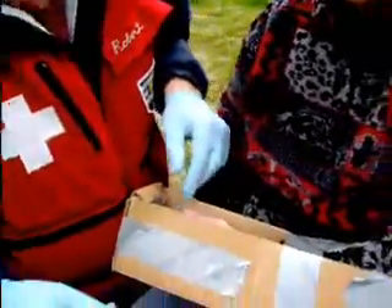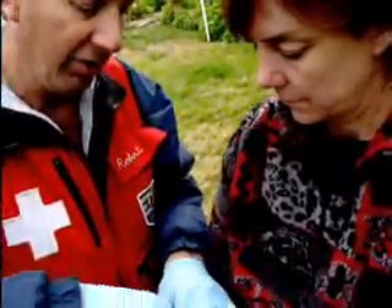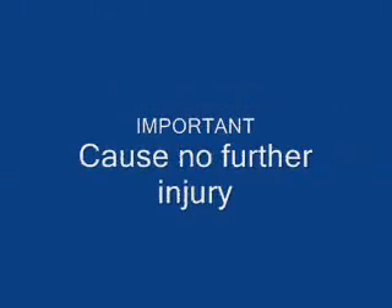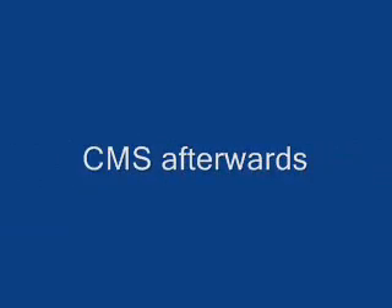That would actually be sufficient. We would now do a sling and swath on here. If we have some cravat, there's a position of comfort for some people. And now I go ahead and check CMS again after I put the sling and swath on.